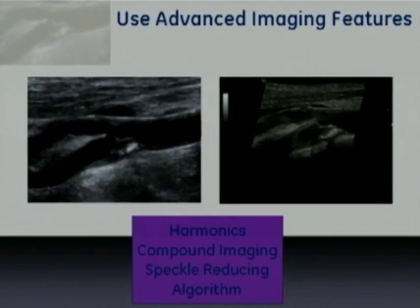Harmonics is particularly interesting because it can sometimes be used to actually visualize the flow. And if we see the flow with harmonics, it's even at a higher resolution than we can ever achieve with color Doppler or with power Doppler imaging, for example. So the image on the right that you see is not some new flow imaging technology. That's simply high-frequency harmonic imaging.